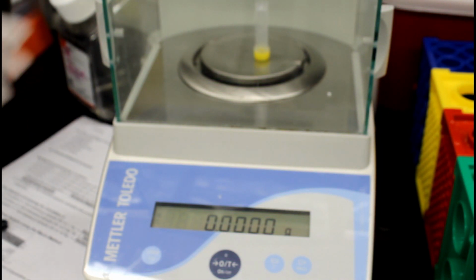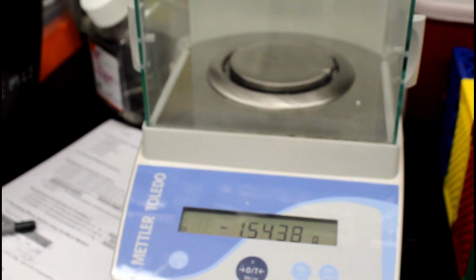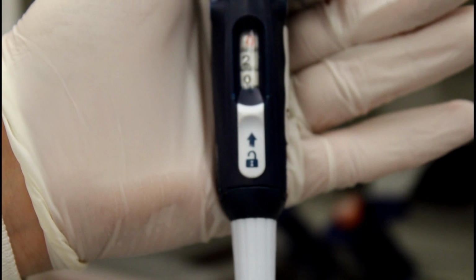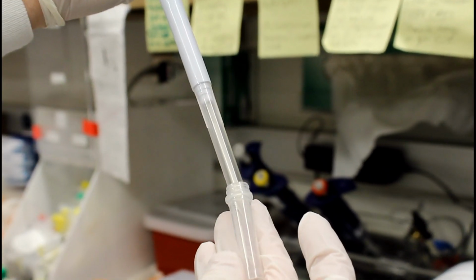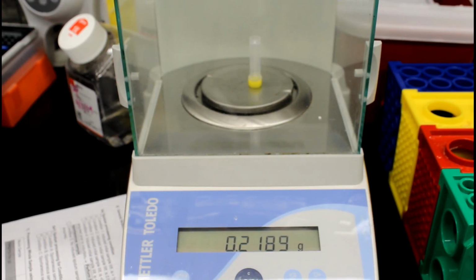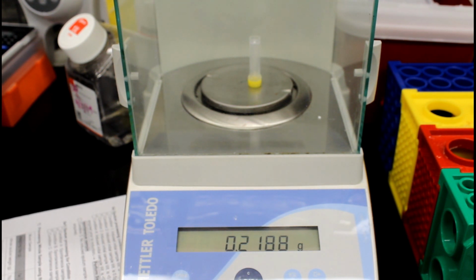From the remaining sample in the tube, acquire 0.2 grams of sample and record the weight. Weigh the sample so you have approximately 0.2 grams.